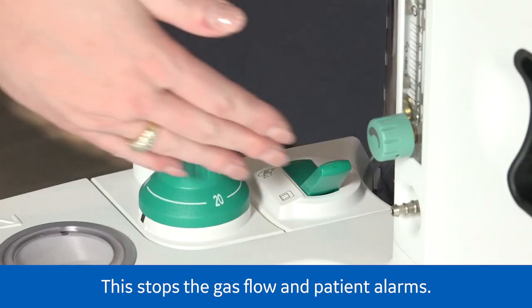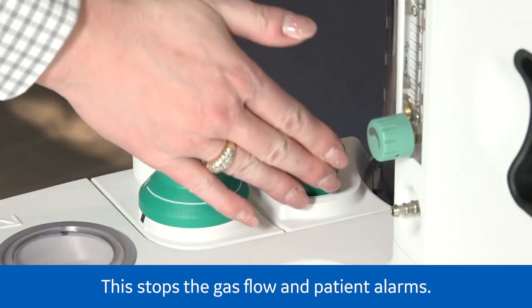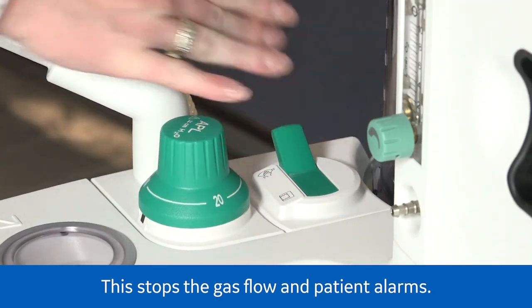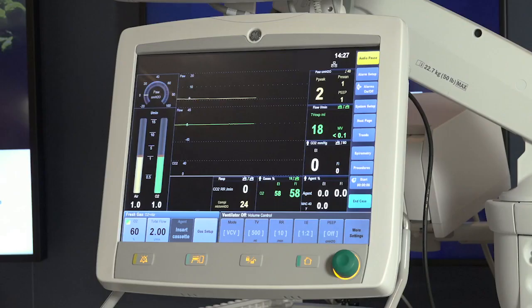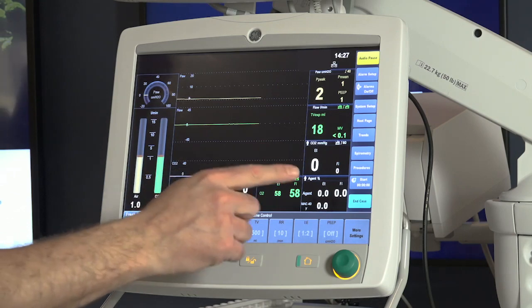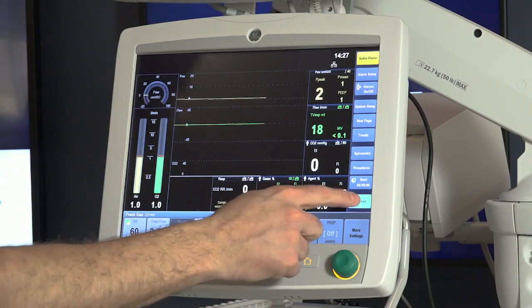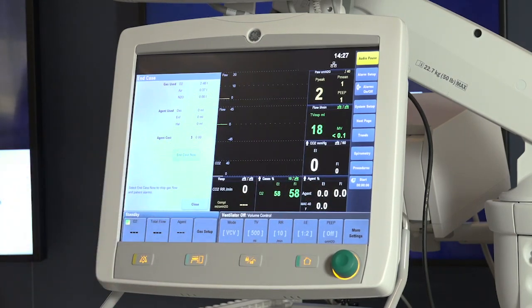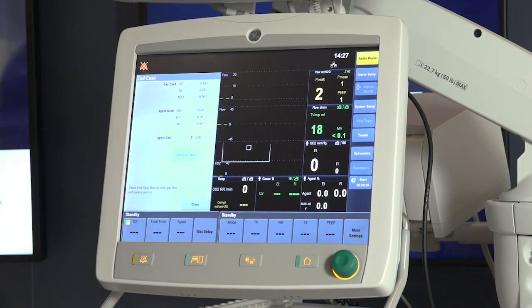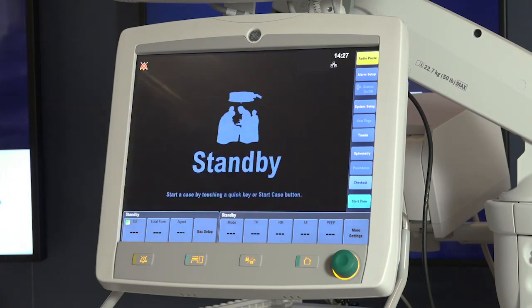To end the case, set the bag to vent switch to bag and select end case. Select end case now on the menu to put the system in standby.